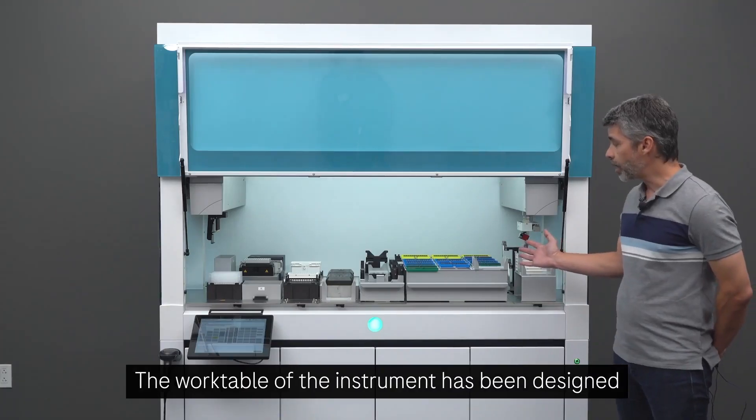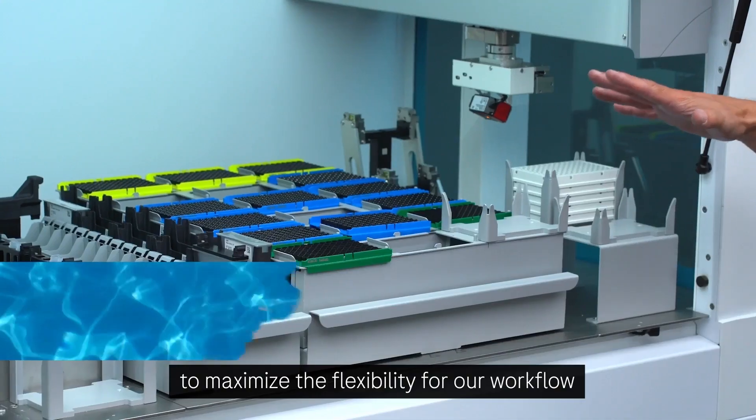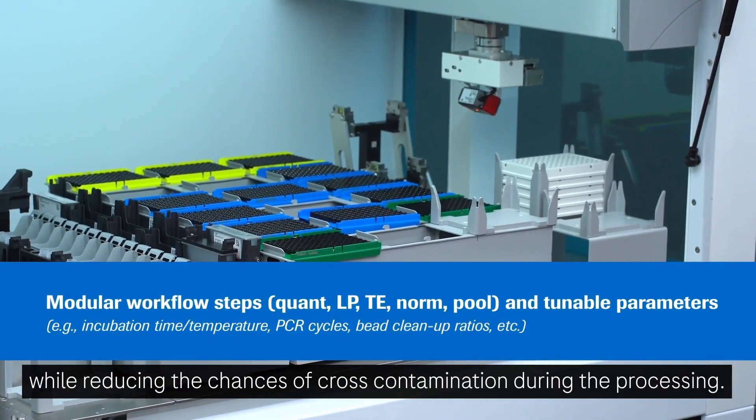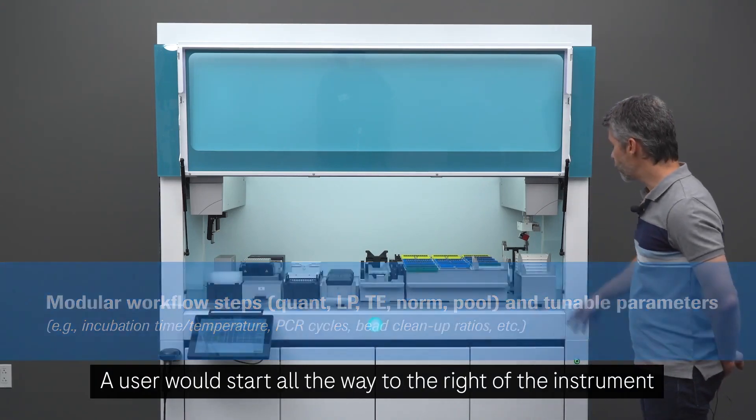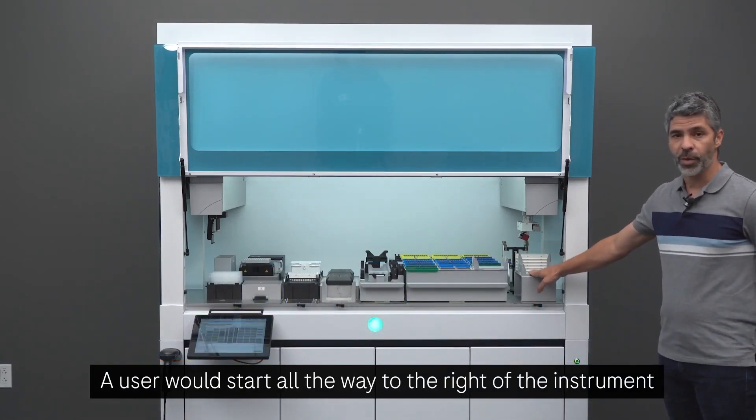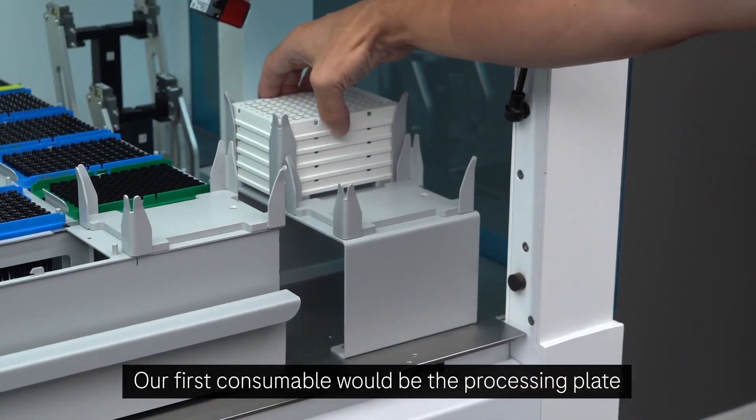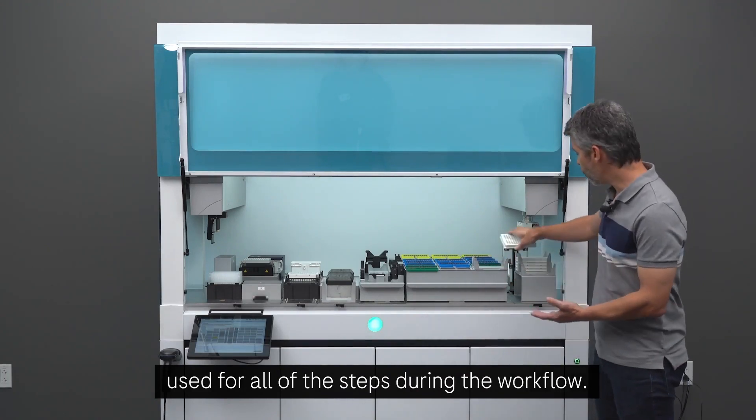The work table of the instrument has been designed to maximize the flexibility for our workflow while reducing the chances of cross-contamination during the processing. A user would start all the way to the right of the instrument to load the consumables. Our first consumable will be the processing plate used for all of the steps during the workflow.